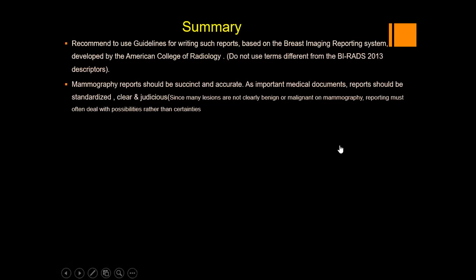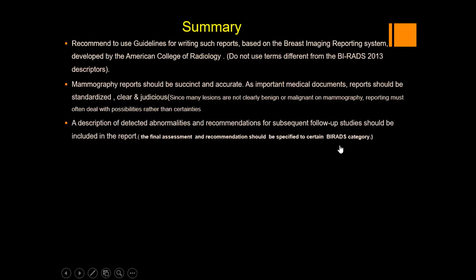Since many lesions are not clearly benign or malignant on mammography, reporting must often deal with possibilities rather than certainties. So there is some flexibility. Descriptions of detected abnormalities and recommendations for subsequent follow-up studies should be included in the report.